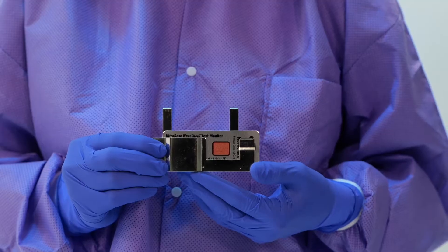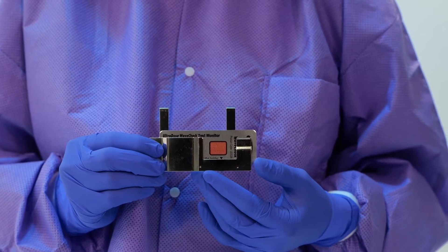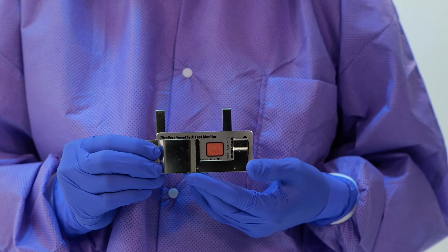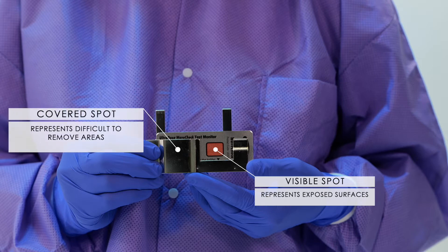The maroon soil spot mimics blood and protein-based soils on instruments and apparatus. WaveCheck tests for all critical parameters and the thorough removal of these soils. When used with the monitor holder, the visible spot represents exposed surfaces while the covered spot represents difficult to remove areas.